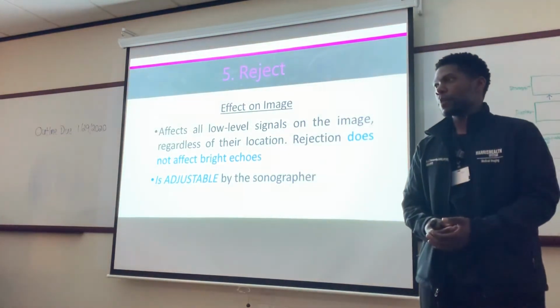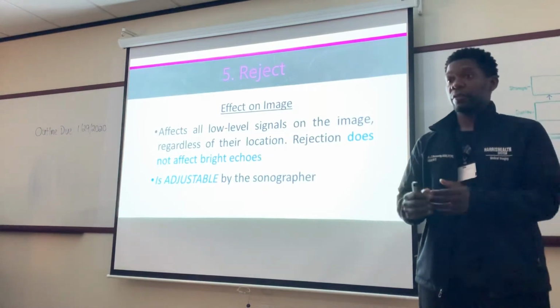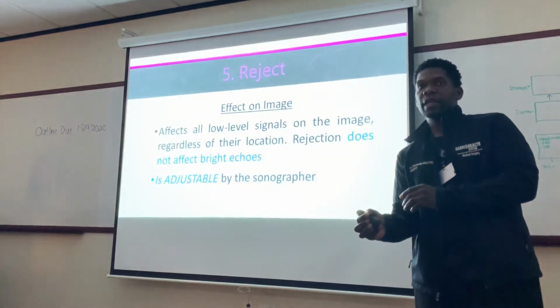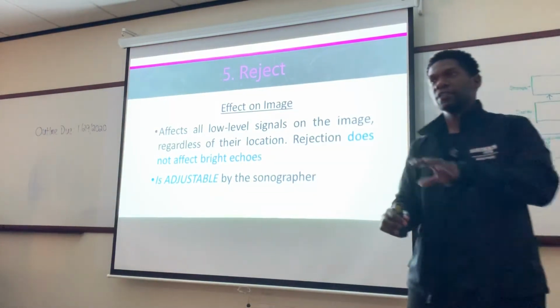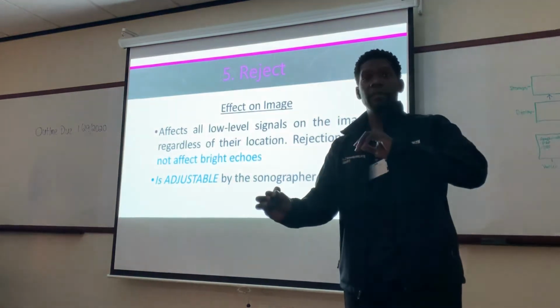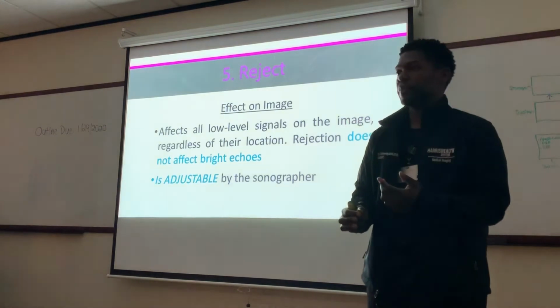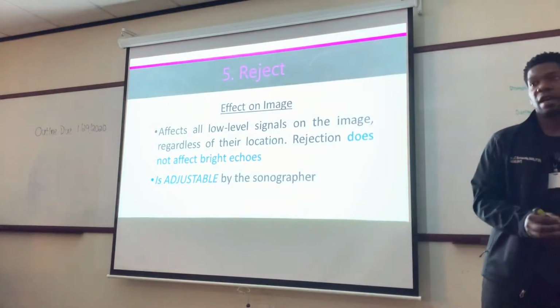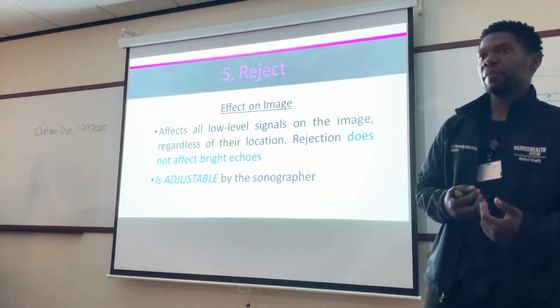Okay? So even though our main job as a sonographer is to find windows and find our images, when it comes to just finding that image, I know you're just first year students, so you're in the phase of, let me just get this image, right? But I'm telling you how to optimize your images, how to make them better. Because that's the difference between a really good sonographer and a really great sonographer, in my opinion: knowing how to manipulate the machine.